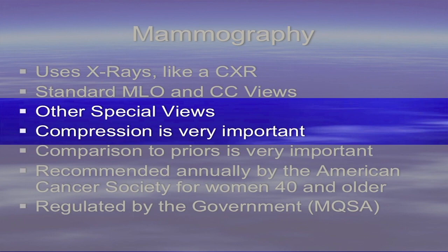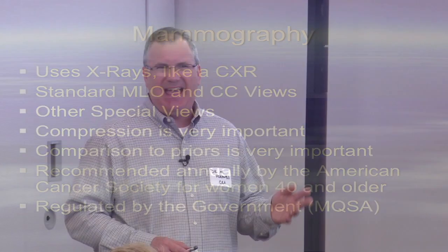Women don't like this, but it's true. Compression is very important. All women have said, if this was invented by a woman, then it wouldn't be so uncomfortable. But the physics make it so that the compression is very important, because you want the x-ray beam to travel through the same thickness of tissue so that you don't get artifacts related to where the breast is thicker versus thinner. So you want to minimize artifacts on the mammogram so that the interpretation is as accurate as possible.